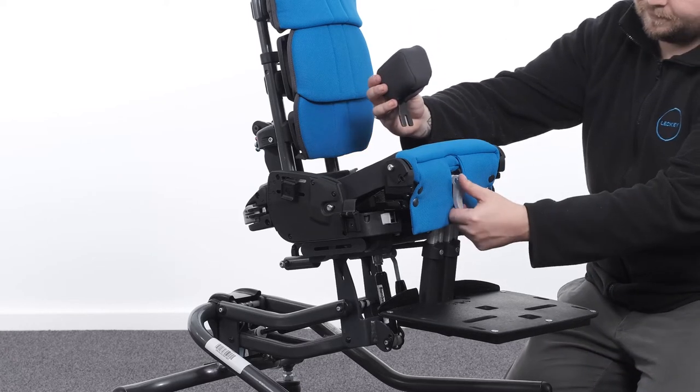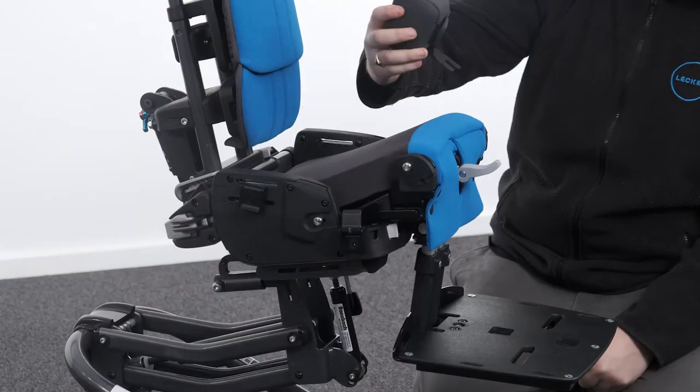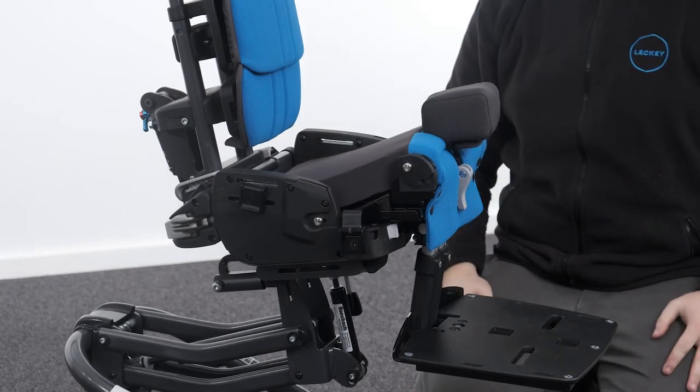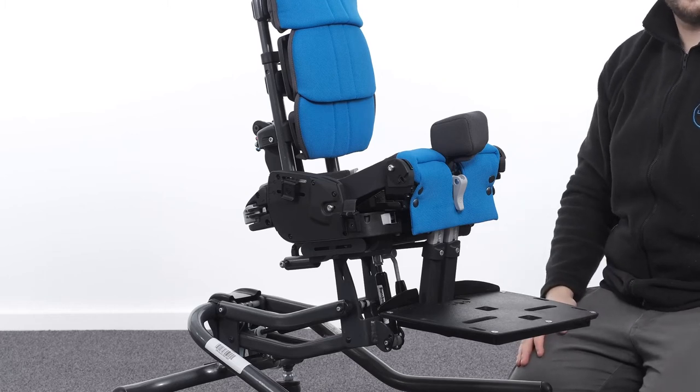Attaching the pommel — basic seat only. To attach the pommel, open the cam lock at the front of the seat and place the pommel bracket through the opening in the seat cushion and into the receiver slot on the seat. To secure in place, push down firmly on the cam lock. Orientate the pommel so that it sits external to the seating area.